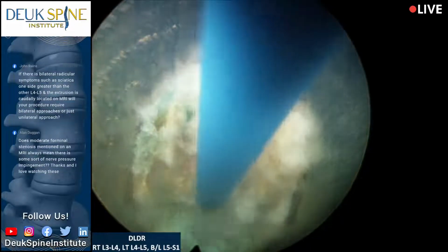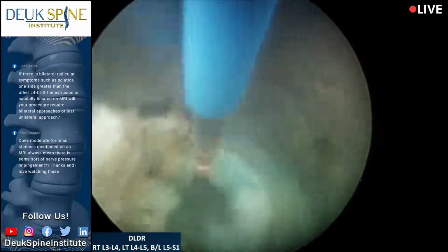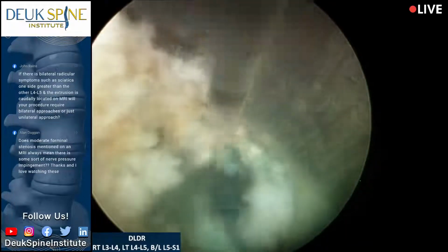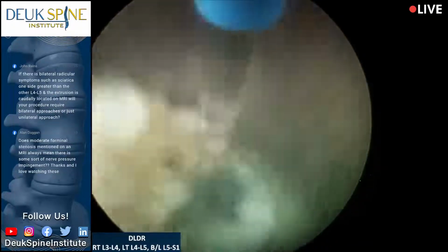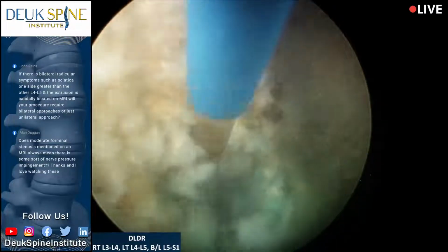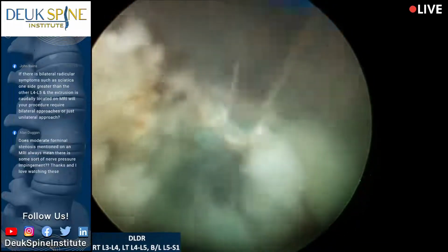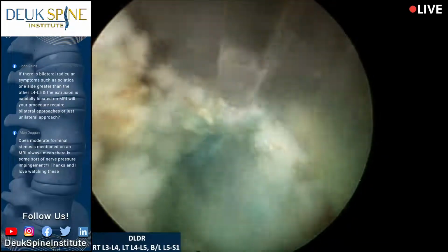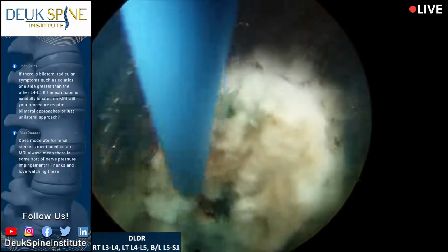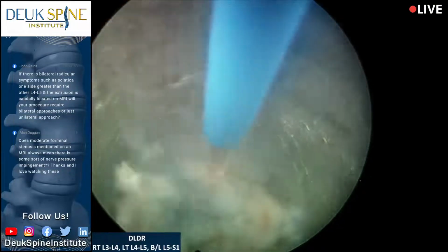It generates the laser energy, and then we transmit the energy from the machine to the end of this little glass fiber you're looking at. Just like fiber optics are transmitted, you know, the internet and all the fiber optic stuff that we use to communicate across the ocean, transatlantic cables, it's all the same thing. It's basically electromagnetic radiation that's transmitted through glass fibers, long glass fibers.